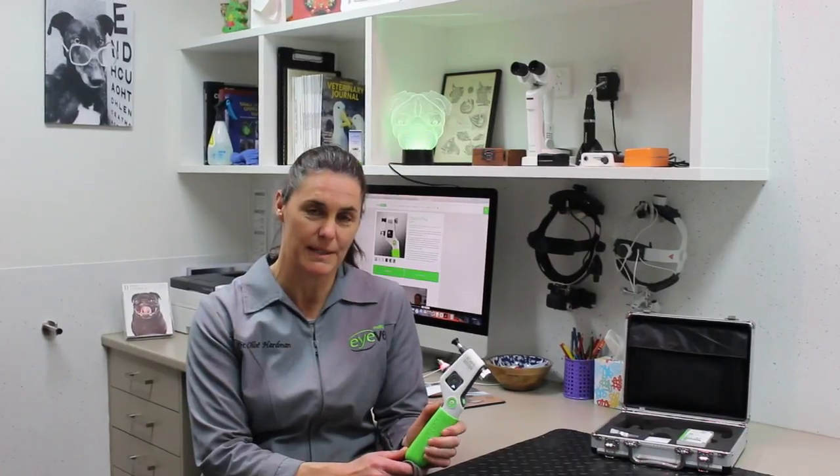We've been using Eye Care Toner Vet tonometers in our practice for over two years and we love them. They're easy to use, extremely accurate, and really well tolerated by our patients.